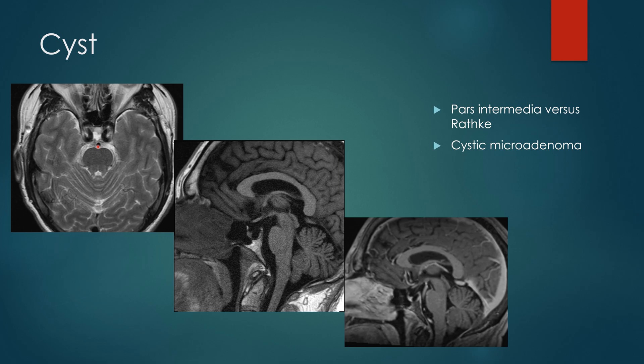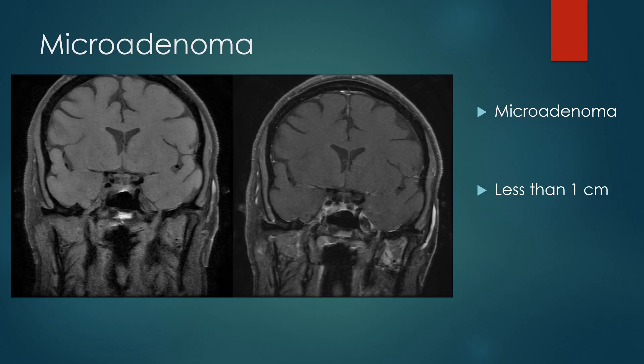Cystic microadenomas are rare. More commonly you'll see them when somebody with a prolactinoma is being treated with bromocriptine — when that micro- or macroadenoma, the prolactin-producing one, is treated, it turns cystic and involutes. The typical microadenoma is described as a hypo-enhancing lesion, so you really need contrast to find one. On the coronal T1 pre-contrast you see pretty homogeneous signal of the gland, but post-contrast, instead of uniform enhancement, you'll see a hypo-enhancing lesion in the left sella measuring less than one centimeter — we call that a microadenoma.